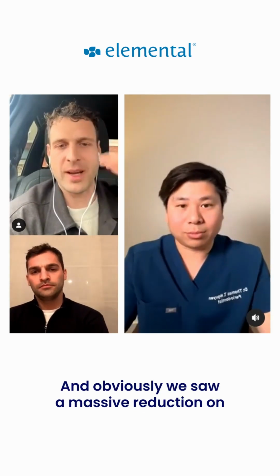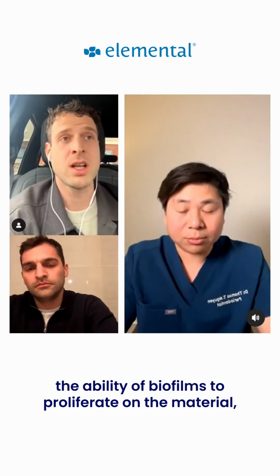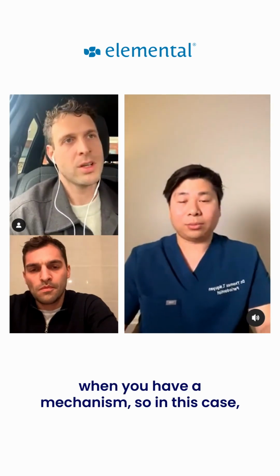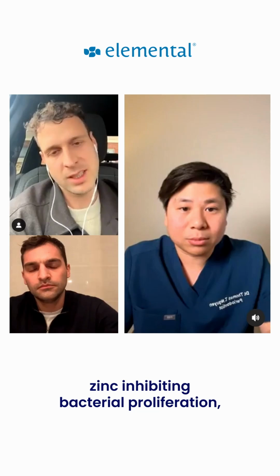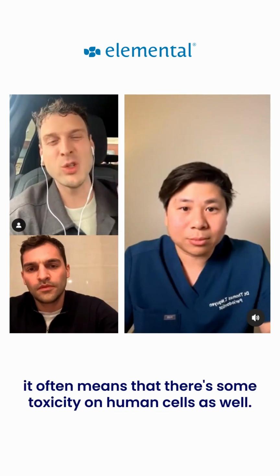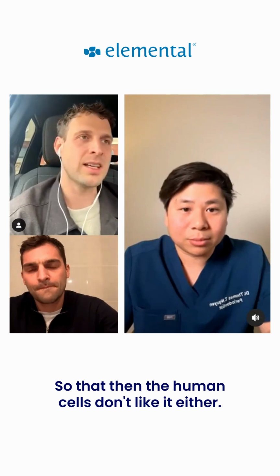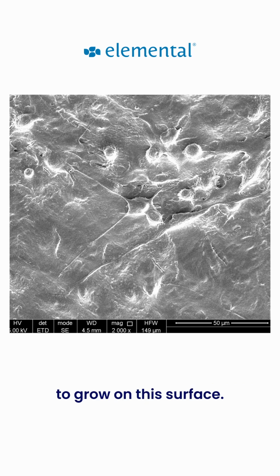And obviously we saw a massive reduction in the ability of biofilms to proliferate on the material. But usually, and this was a very good point of Professor Teugels, when you have a mechanism, in this case zinc, inhibiting bacterial proliferation, it often means that there's some toxicity on human cells as well, so that then the human cells don't like it either. But we actually saw an increase in the ability of keratinocytes to grow on this surface.